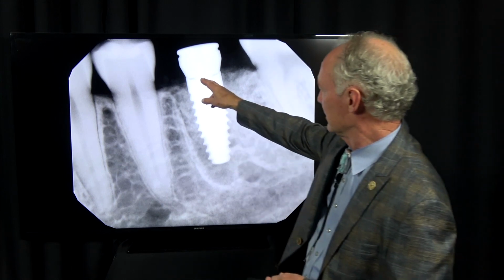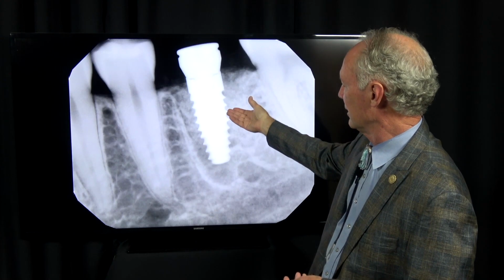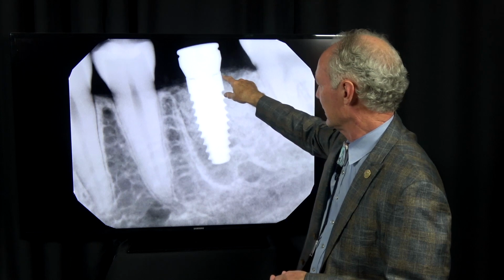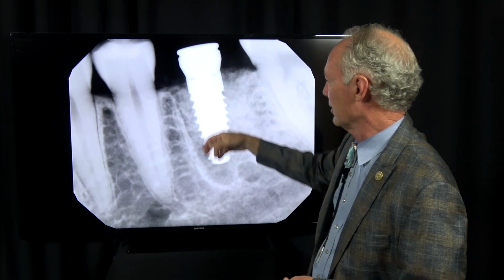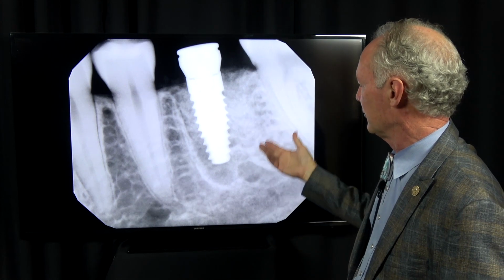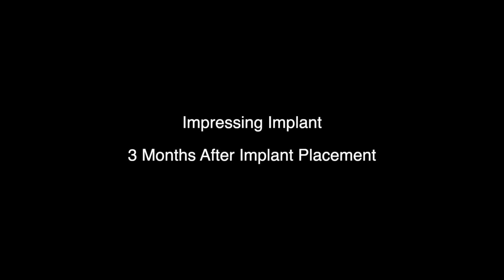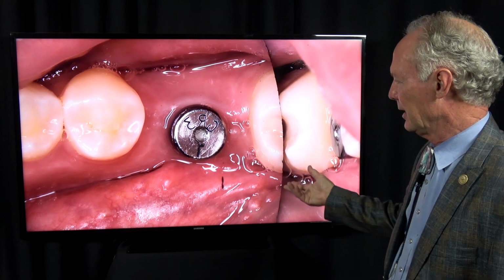And we'll leave the healing cap in place, and it goes through the tissue, so you're going to form a nice emergence profile. If you reflected a flap and placed the implant, you'd put a flat healing cap, so you'd have to go back in 3 months and take a core, and then it's just a lot more involved for you and the patient. This is, in my opinion, a lot simpler and very accurate. So 3 months later, the implant has osseointegrated.